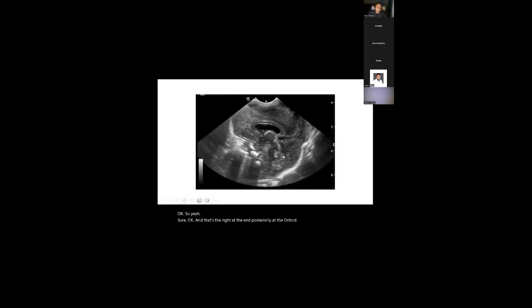Sagittal view midline. It's brilliant. So corpus callosum. Here is the cerebellum, the pons, fourth ventricle here. Correct. And you can see the third ventricle as well. Is this the third ventricle? I'll just highlight it for you. So this is basically the third ventricle. That's the fourth ventricle, cerebellum that you can see. And this is the whole of the ventricular system. Okay. It's demonstrated beautifully. And can I just say, you've demonstrated the corpus callosum anterior to posterior. It's brilliant. You've got a lot of extra-axial space.